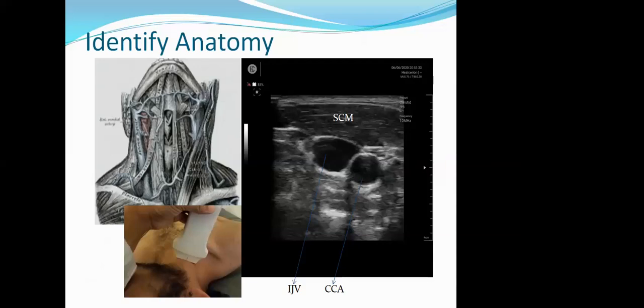So now here we will give you a little bit of tip about how to identify the anatomy. So you put your probe on the patient neck. Always remember that the orientation is a very important point when you are performing any procedure, or when you are performing the ultrasound procedures, or you are scanning. On every probe of the ultrasound, you will see a marker.